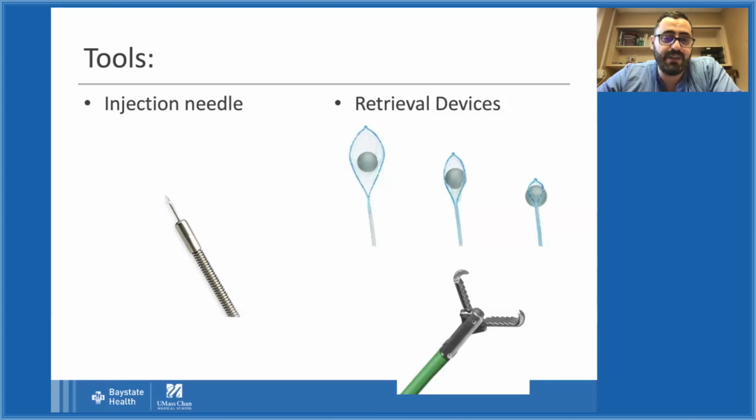And the purpose of the tattoo usually is for future reference. So sometimes when we remove a large polyp, we want to follow up on it in 6 or 12 months to make sure it's not coming back. And when the polyp site, or the polypectomy site, heals, it can be difficult to find. So we place a tattoo just to make sure we are at the right spot.